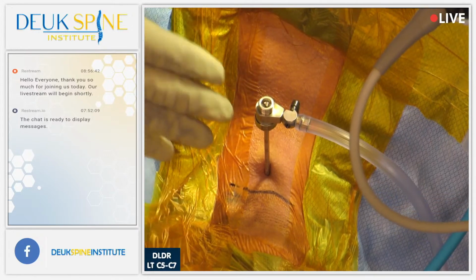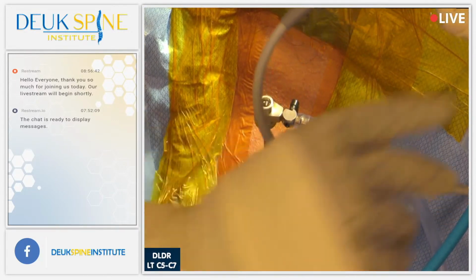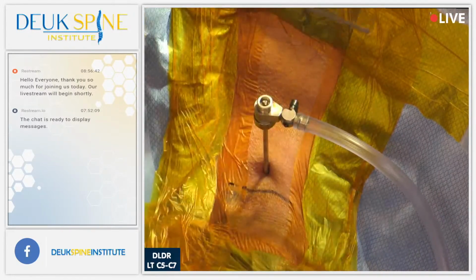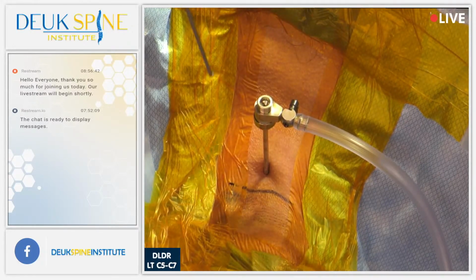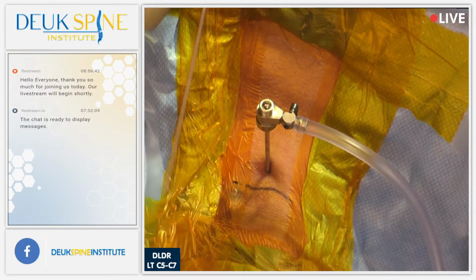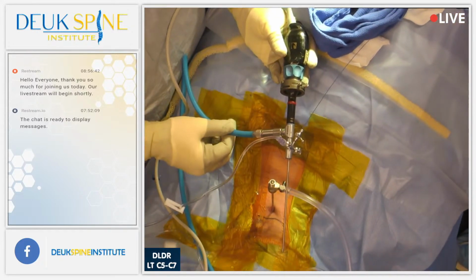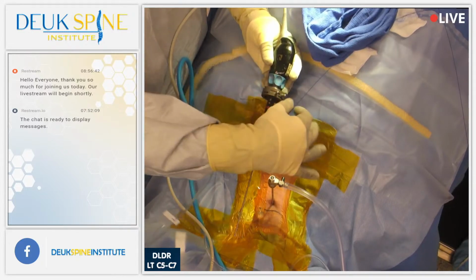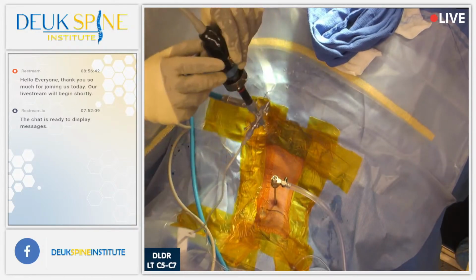The entire spine world will eventually go to endoscopic. Unfortunately, it's been corrupted by greed and ignorance. And so until that gets fixed, people are going to still get fusions and artificial discs, which they shouldn't be getting. All right, so this is the endoscope, for those of you wondering. This is a suction line. This is the light source, the camera. This is the endoscope. This is the laser fiber. This is the irrigation. And this is cold irrigation.